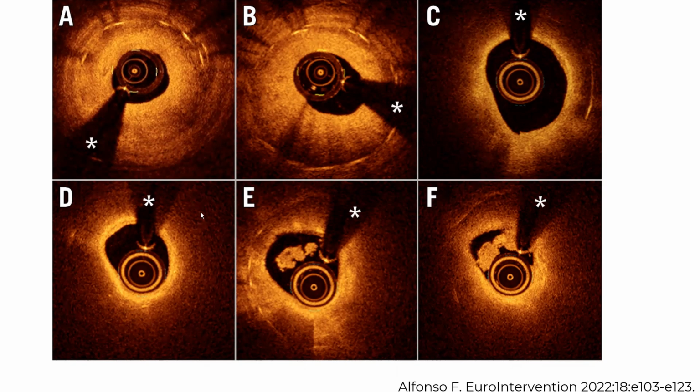Those images are important for interventional boards. So you have a fibrous cap here, then you have a lot of lipid behind it. This is neoatherosclerosis. You cannot even see the stent struts in this patient. You can barely see them here because the lipid creates shadowing and it shadows the stent struts. You can see the stent struts here in neointimal hyperplasia without lipid.